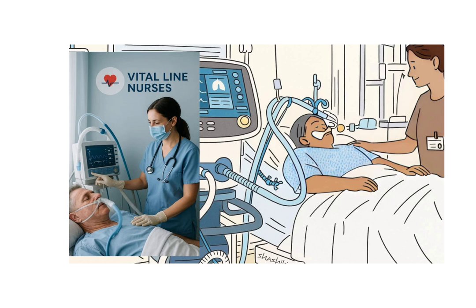3. Suction the airway as needed. Suction when you hear gurgling sounds, see visible secretions, or the patient is coughing and desaturating. 4. Secure the endotracheal tube, ET. Check tube placement regularly, prevent dislodgement, and rotate the tube position to prevent lip injuries.